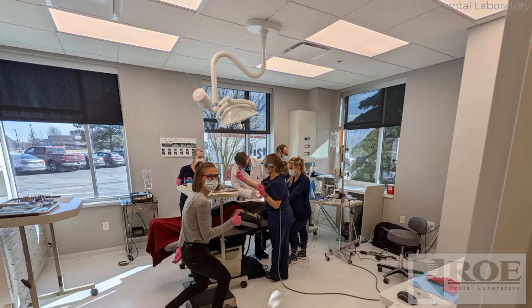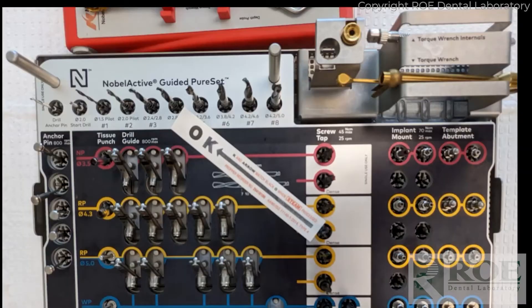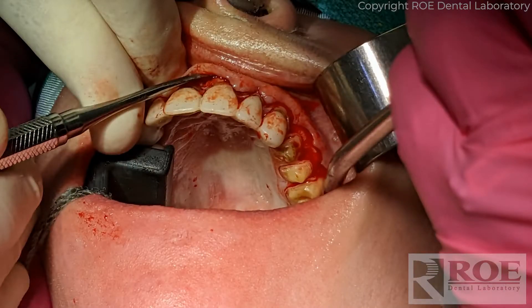This is a nice view of the room — this is Dr. Fried's new surgical suite, very big room, very nice to work in. This case uses a Nobel Active kit. As usual, the pin guide is tried in.